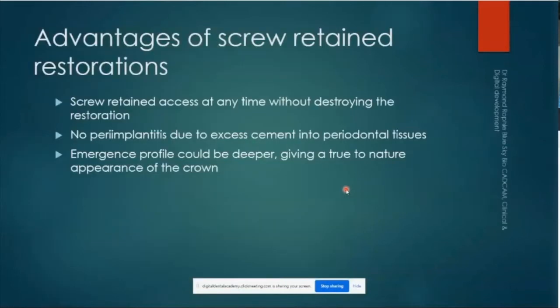Regarding the thickness of the restoration, you will always have a very good aesthetic result. I don't think that I need to speak about why the screw retained restoration will be used for these cases, or why I prefer it. However, you have a ton of advantages here. Number one, you can access your restoration anytime you want, even after you finished it and a number of years after that. You can always access it and unscrew it. If you need to change the color, make any changes to your restoration, or check the inside of the implant, you can always get access to it.